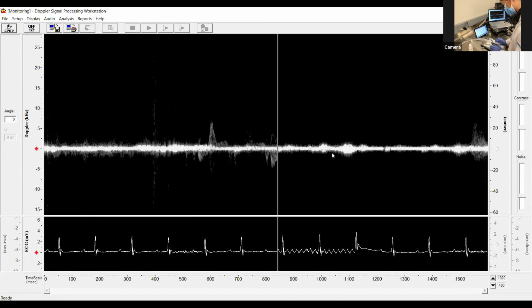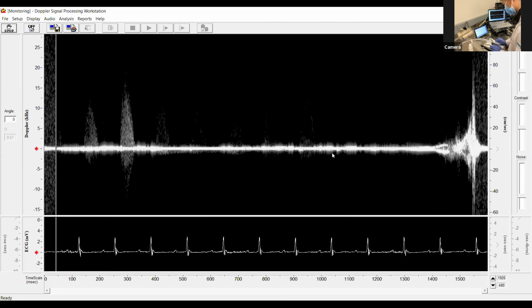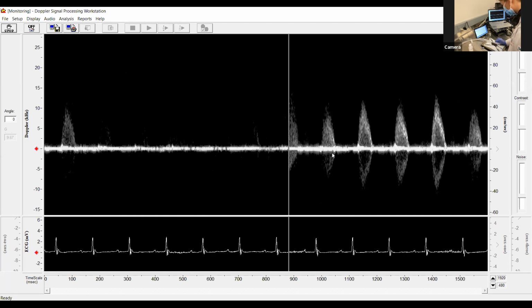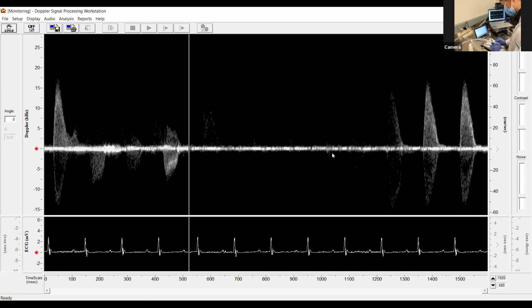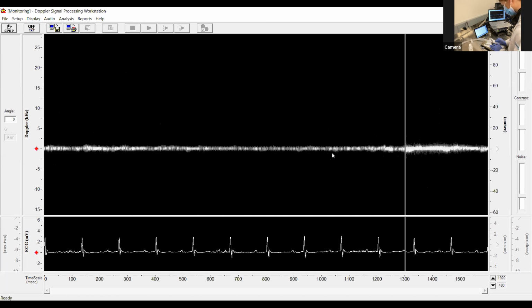Okay, you can also approach this from the other side, but traditionally we will do it in the positive direction. Again, if you had stenosis here, you would see an increase in the velocity, and the sound changes almost entirely. It becomes very static-like rather than the sharp piercing sound that we hear.